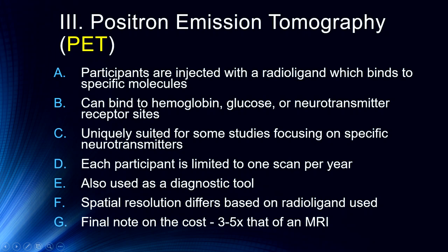Also, they have pretty terrible temporal resolution because, remember, we have to use blocked scans. And so we can't see any events unfolding over time. The best for that are the electroencephalographic tools we've talked about in previous lectures, event-related potentials, magnetoencephalography, etc.